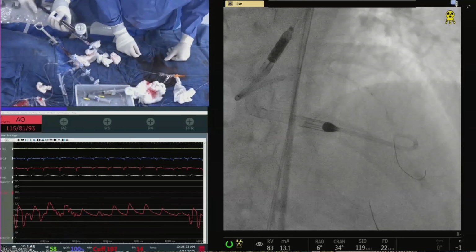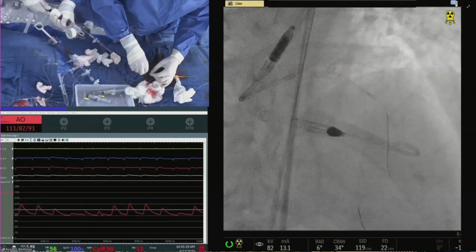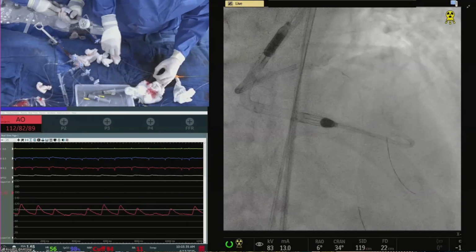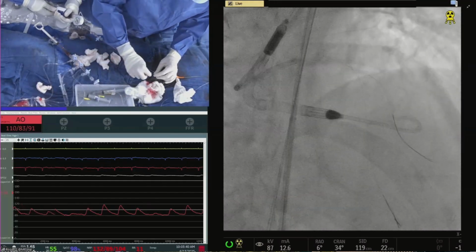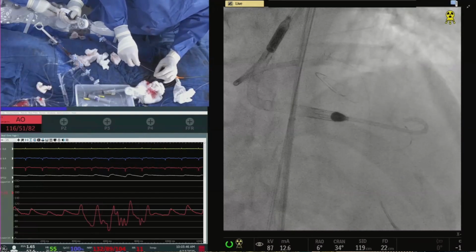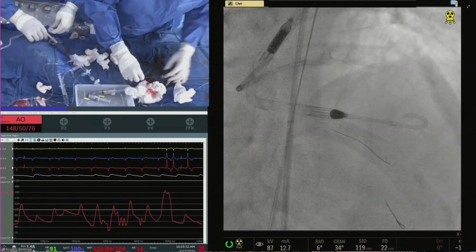It looks like your balloon went, so you did do something there. Yeah, no, but way further down. The balloon didn't go more distal, the lesion is distal. I may need a new balloon, I think. This is not making anything. So 1.5, probably 1.5. If it really is that hard and nothing is going at this stage, I will leave it alone because we've got to focus on everything that came out, telling us that there is still so much calcium.